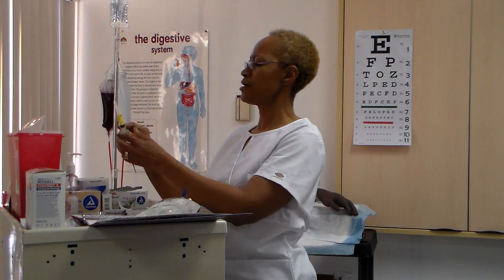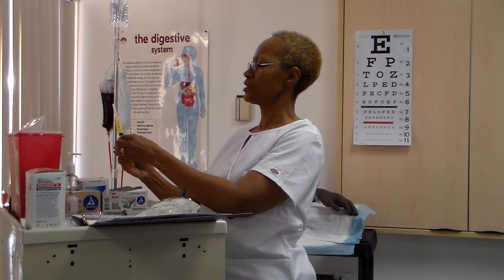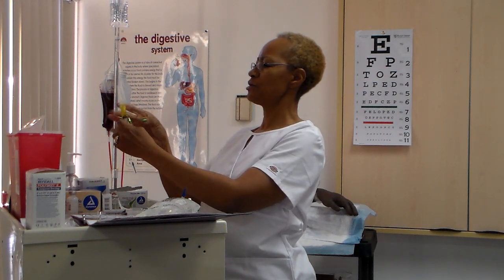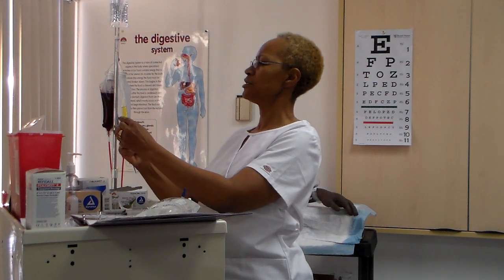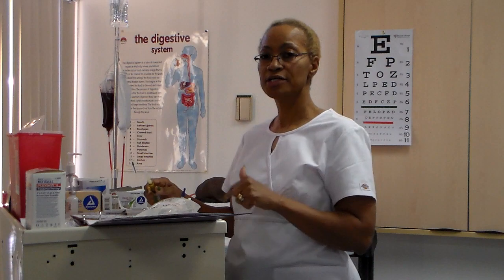You have the correct amount. Do you have any air in there? Same method that we did last week. You're going to tap your syringe, getting the bubbles out, in order to determine do you have the correct amount of medication. You've already cleaned your port.